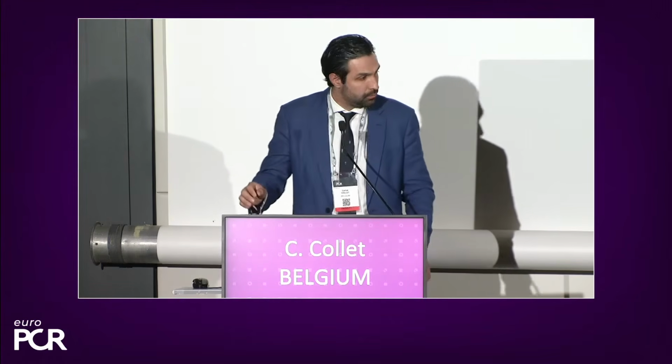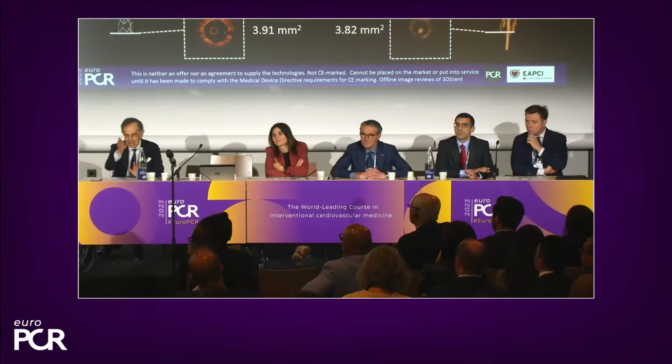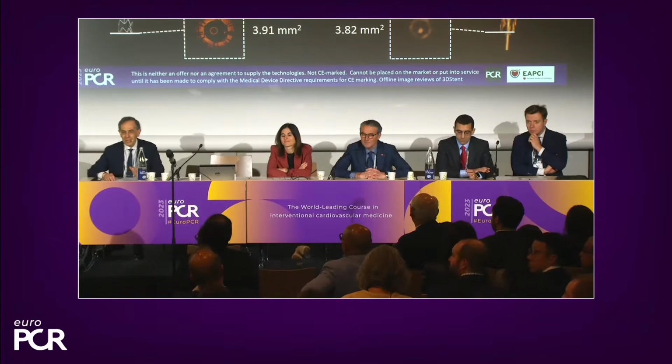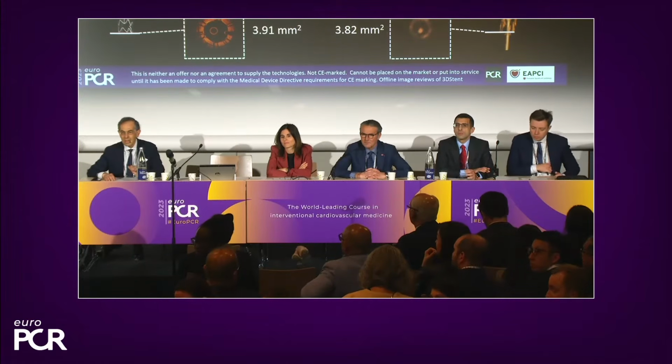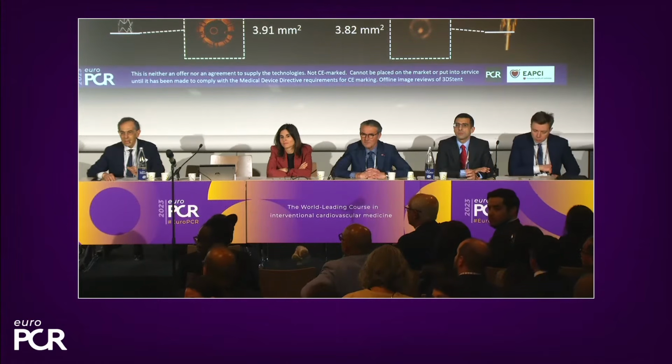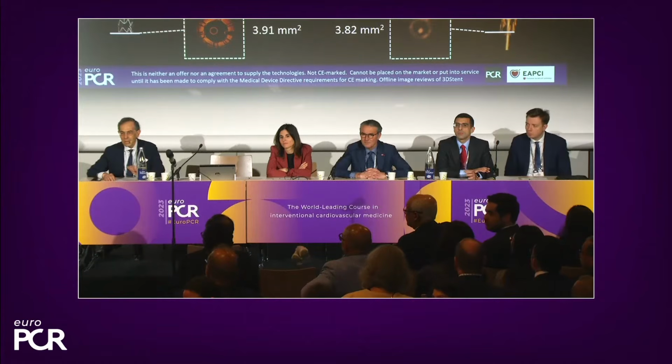I said one question, but there is one more. That is the last. Go to the microphone and say your question. Right, so the comparison that you mentioned between the OCT and the 3D stent, at the best you said the 200 degrees rotation as opposed to the OCT, which would offer you a circumferential information.